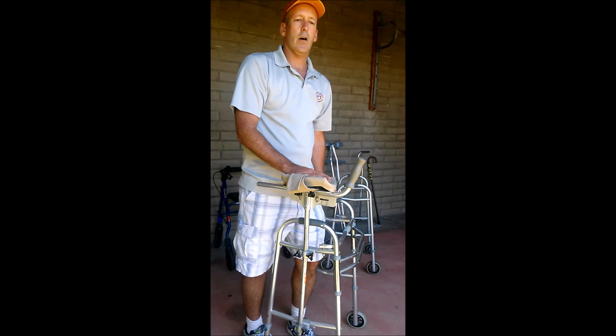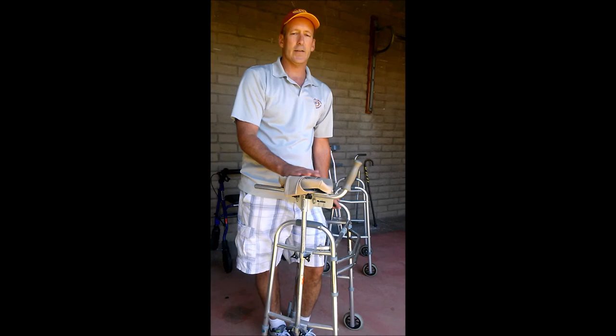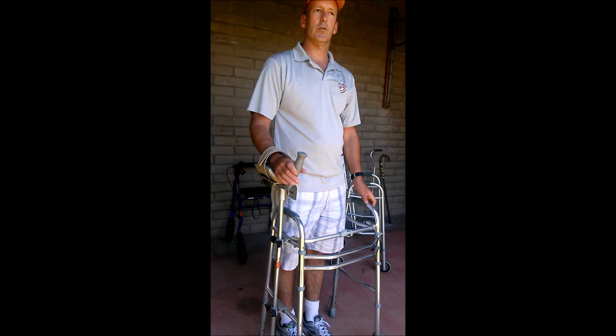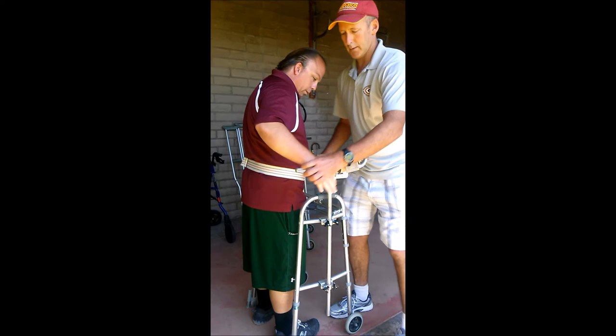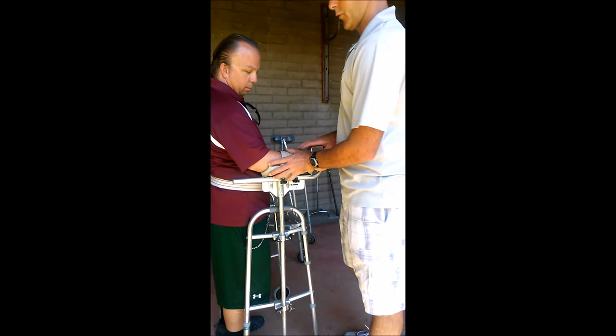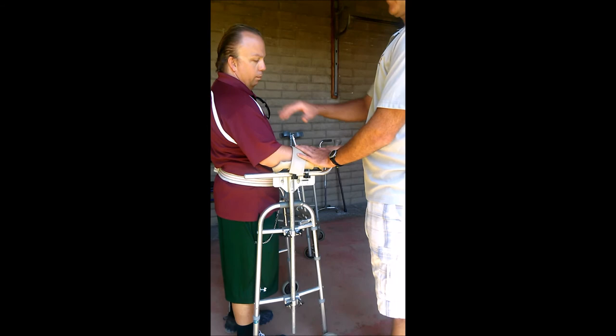We also use the arm trough a lot for individuals who've had a stroke or traumatic brain injury. If someone had a stroke on the left side of the brain, the right side of their body is affected, and they may do better using something like this initially. John, come on up here - we already have the gait belt on you. This is nicely fit for you; let's have you put your arm in there. That's a nice 15-degree bend - same as what we're seeing on the other side.